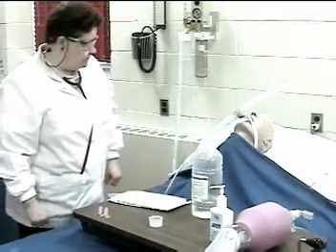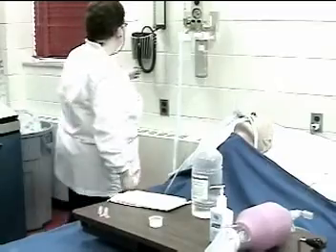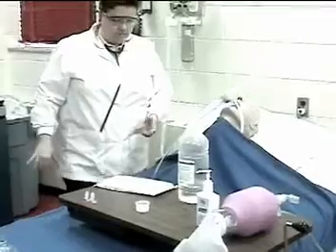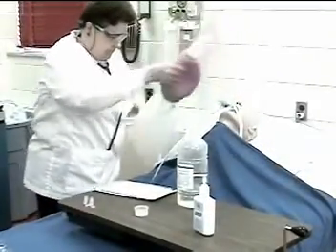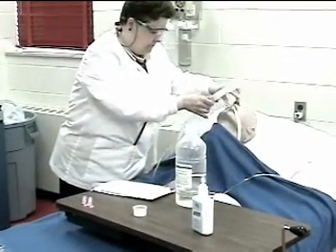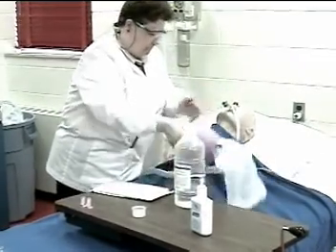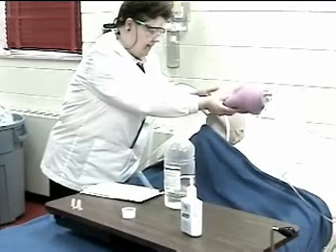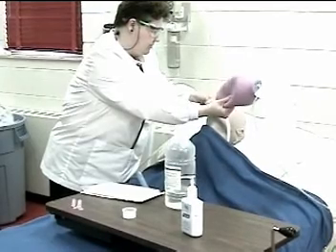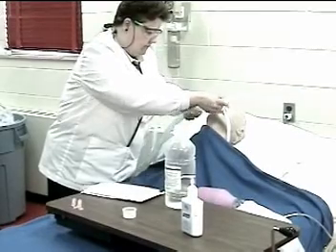Hyper-oxygenates and hyper-inflates the patient. This can be done by increasing the FiO2 on the aerosol delivery and/or using a resuscitation bag ventilating through the endotracheal tube. Let me just give you a couple big breaths, okay?